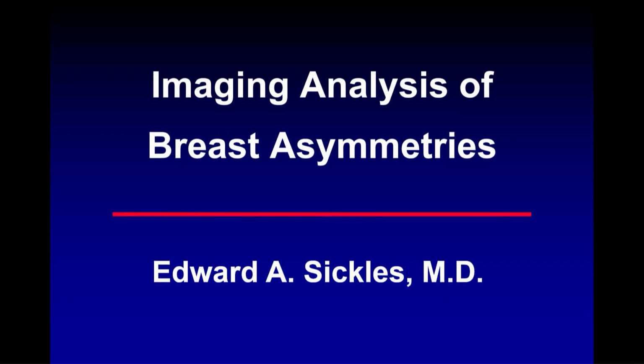Asymmetry is one of the more difficult parts of mammography. First of all, understand asymmetry is unique to mammography. There is no asymmetry in ultrasound or MRI. They have non-mass, but most of the asymmetries we see at mammography will not correlate with non-mass at either MR or ultrasound. So this is sort of a unique thing.